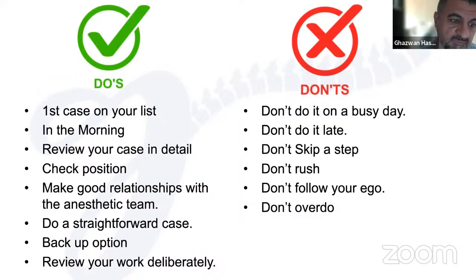From my perspective, I prefer to do the case as the first case on the list in the morning, review the case in detail, check the position, and make a good relationship with the anesthetic team because you need a stable mean pressure. Start with a straightforward case. We all agree about that. Have a backup option in your initial cases, and review your work deliberately. I don't prefer to do it on a busy day, especially in my initial cases.